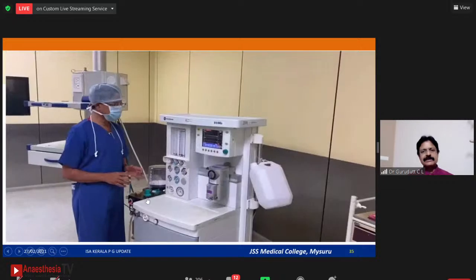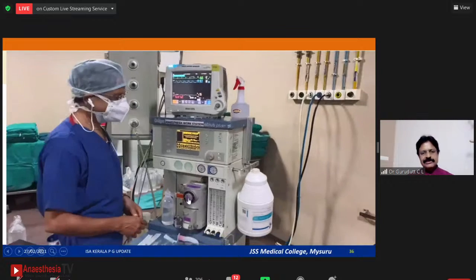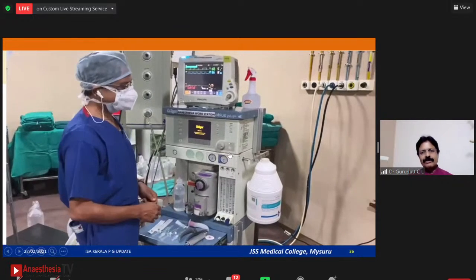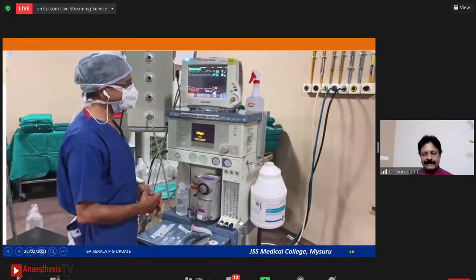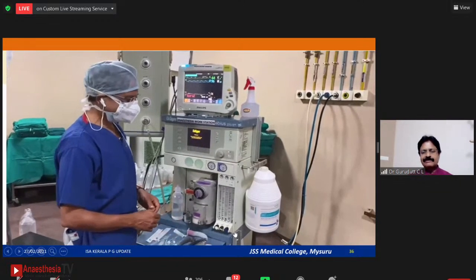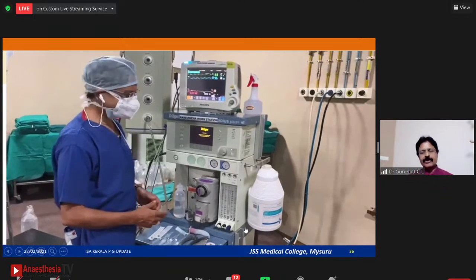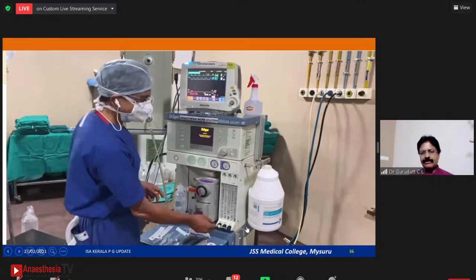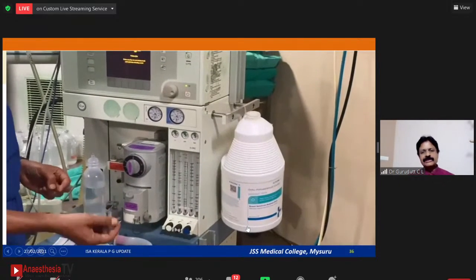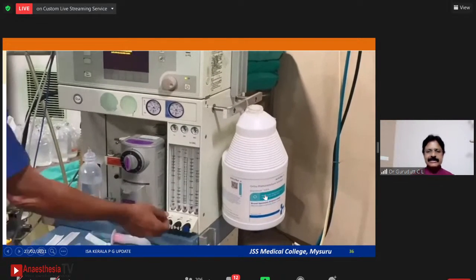Now let us see how the Draeger ORMC works. In this video, you can see this is the ORMC or SORC of the Draeger Fabius Plus. I'll try to open nitrous oxide. Unless I open oxygen, the nitrous oxide slave control valve will not open and the nitrous oxide cannot flow. If I have not opened oxygen, then with any rotation of the nitrous oxide knob, I will not be able to open nitrous oxide. This is in contrast with Link 25.